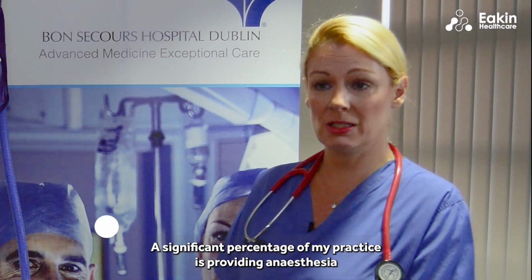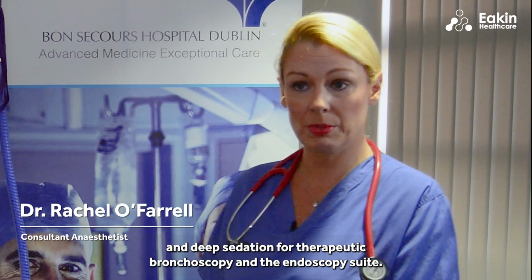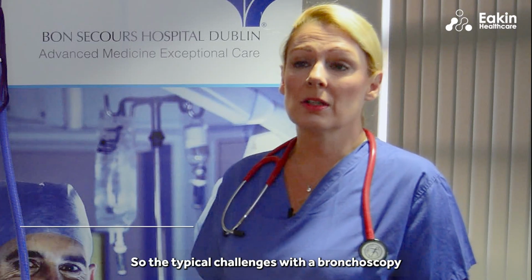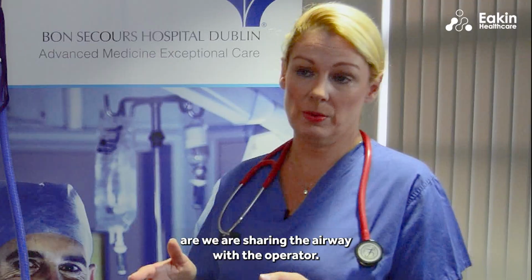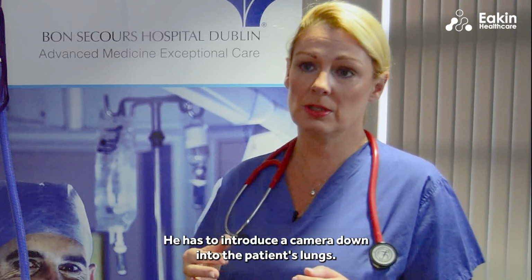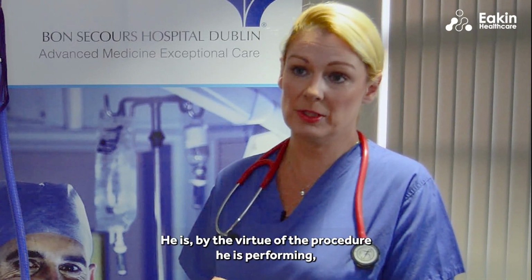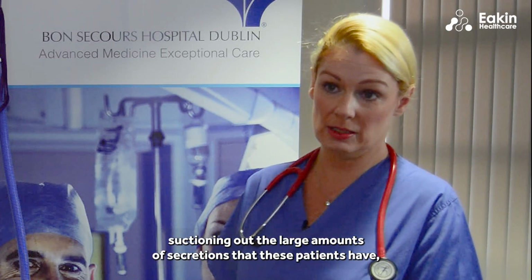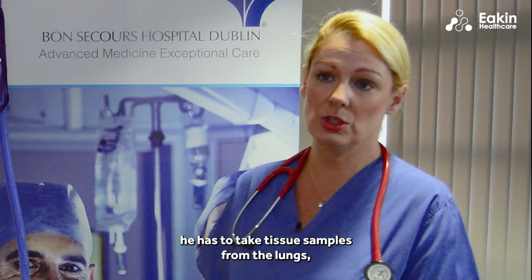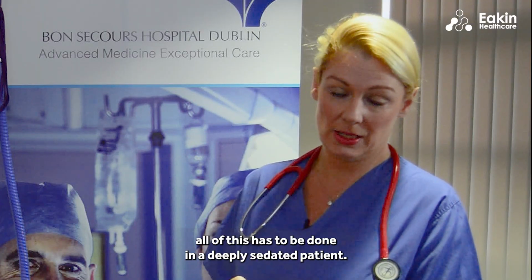A significant percentage of my practice is providing anaesthesia and deep sedation for therapeutic bronchoscopies in the endoscopy suite. So the typical challenges with a bronchoscopy are we are sharing the airway with the operator. He has to introduce a camera down into the patient's lungs. He is, by virtue of the procedure he's performing, introducing fluid and saline down into the patient's lungs, suctioning out the large amounts of secretions that these patients have. He has to take tissue samples from the lungs. All of this has to be done in a deeply sedated patient.